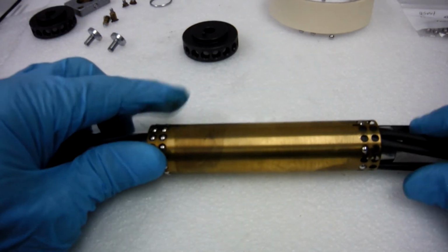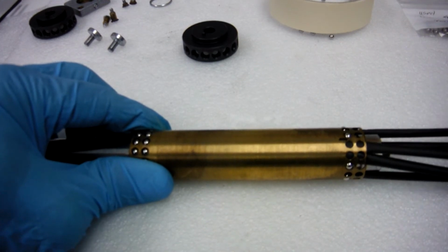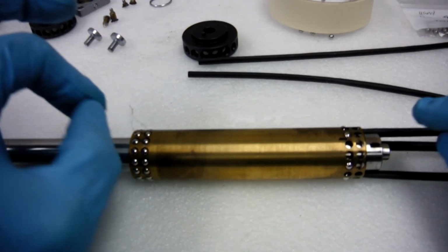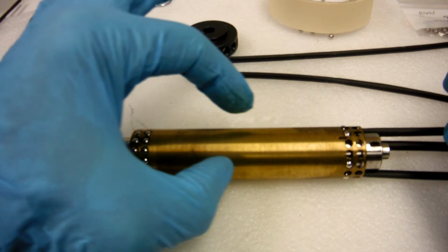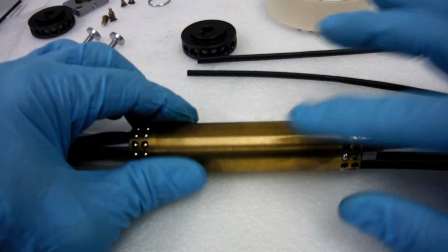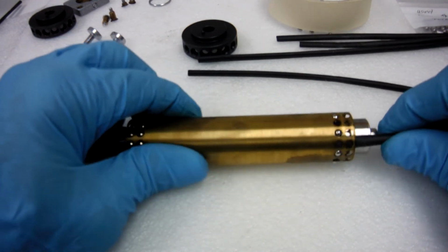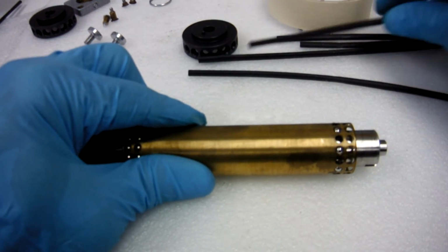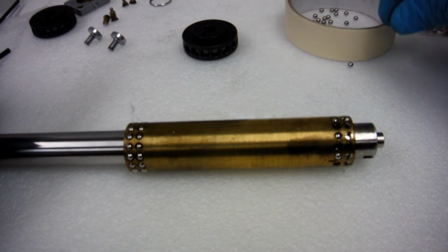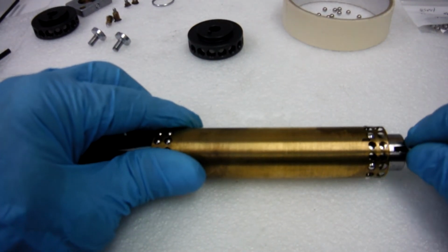We have one all the way around, so we can go ahead and remove our heat shrink. Now if you were doing both sides, you could just slip your heat shrink out of the way, but still remain on the other side so that it would stay round. But since we're round, we've got a bearing in every other hole, we don't need our helping heat shrink. Okay, now, being careful, we're going to fill in the gap.